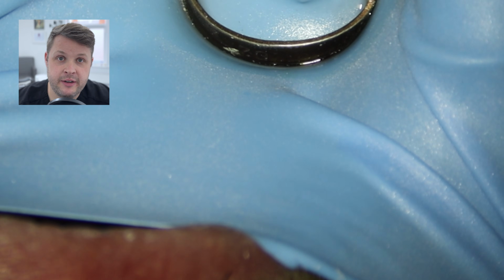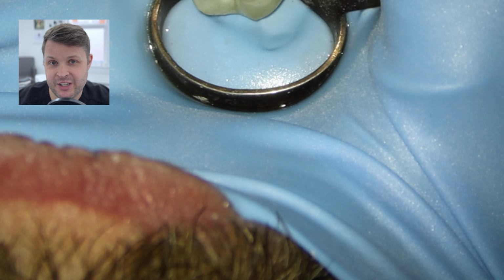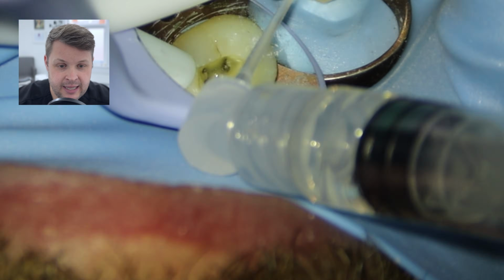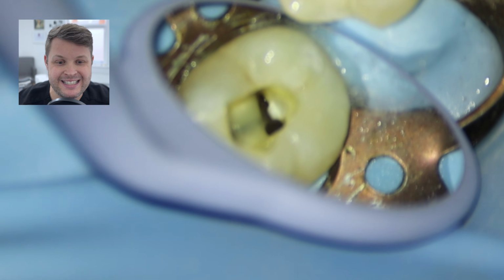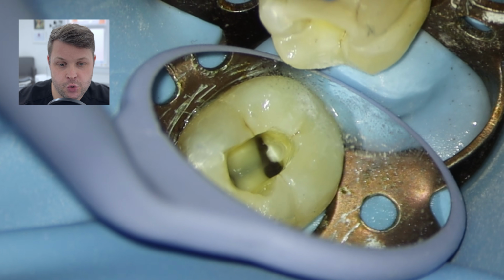We know that there are 2 canal orifices in this tooth, and I'm having a little feel down both of these canal orifices, and I can get down the DB canal quite easily. Obviously there was no mucking around, we just used the same protocol again, 15, 20, 25. Once we've finished shaping this DB canal, we'll call it DB canal because really it's the same canal. We can see that there are 2 orifices, but they join, okay?